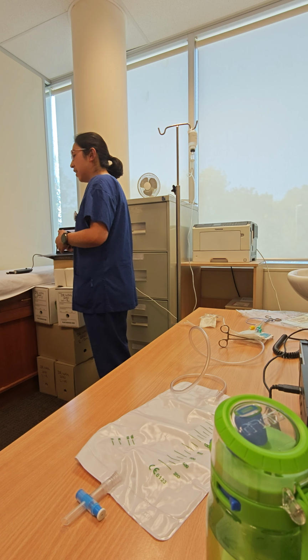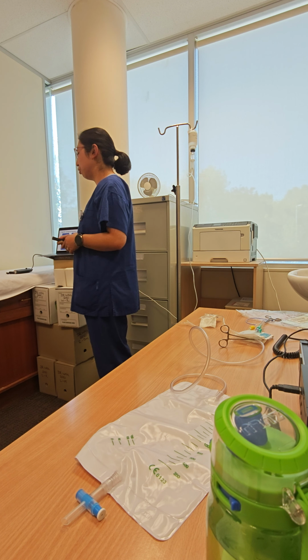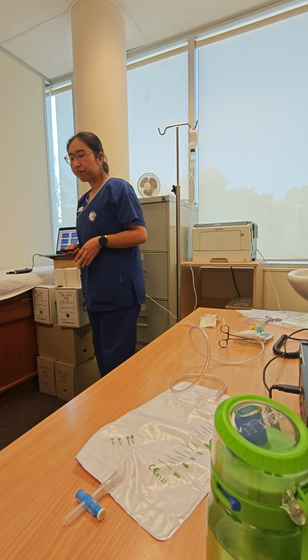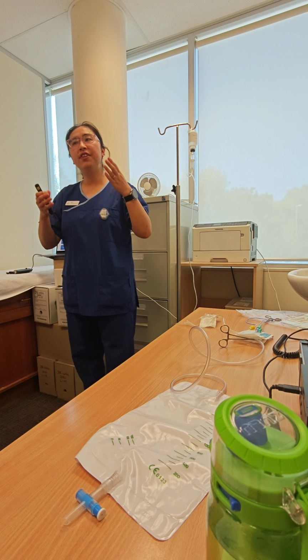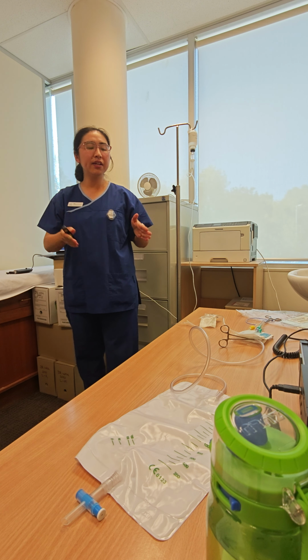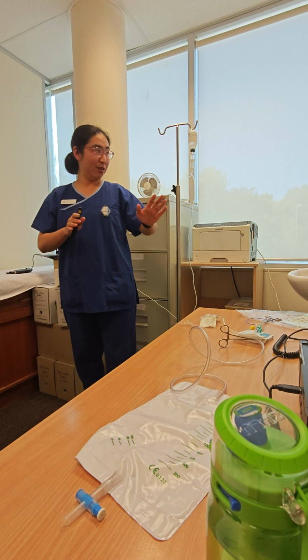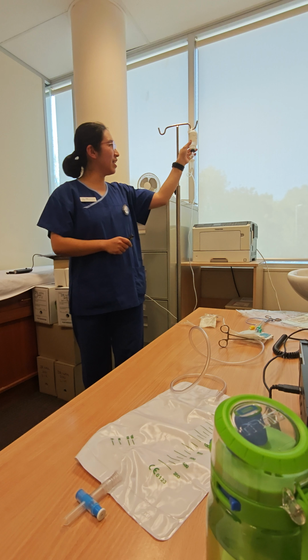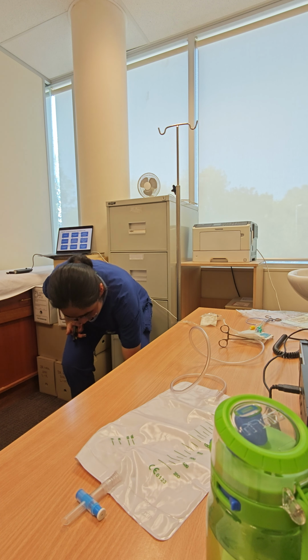And he's gonna leave, and now it's your job again to take over everything in the room. Before that, we need to bring the bottle down to the floor.